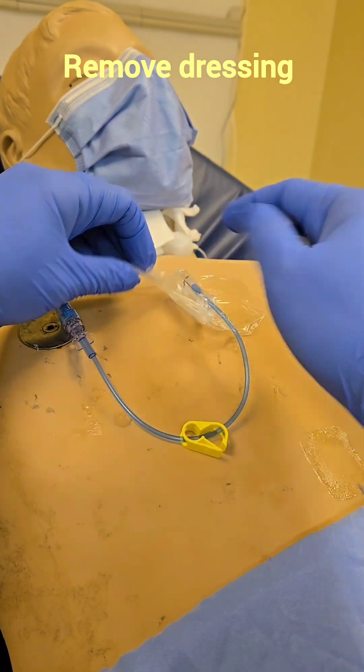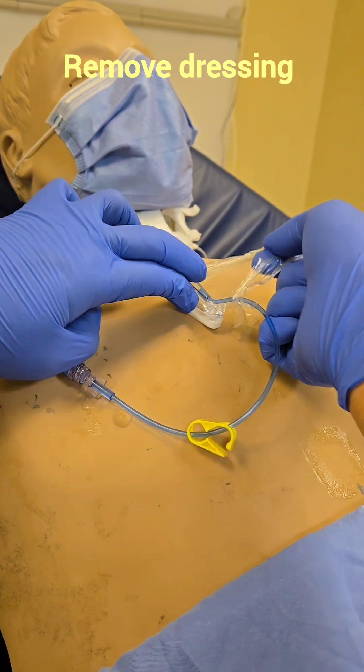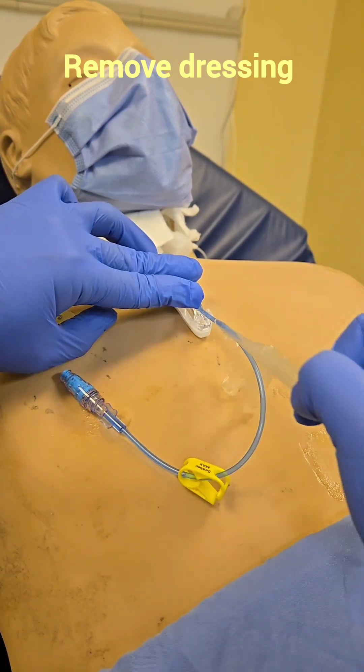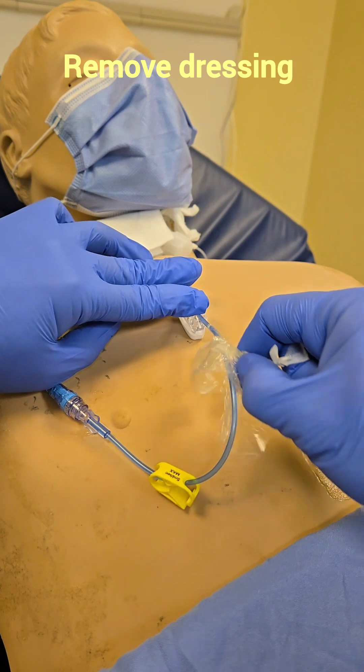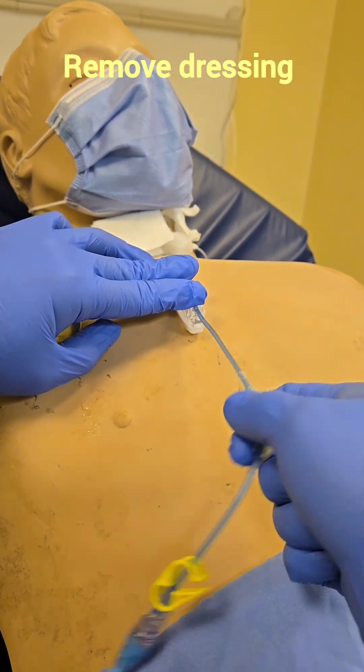When you remove the dressing, always make sure you stabilize the portacath so that it doesn't accidentally get pulled out as you remove the dressing.